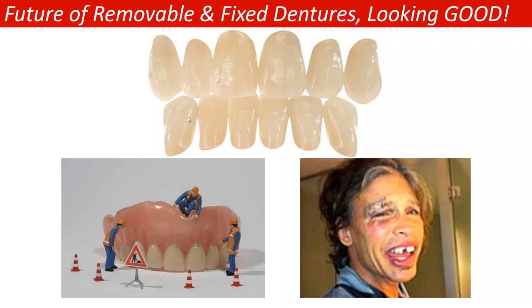If the occlusal table has the right adjustments, there's no interference, and you have that group function, you should not see any denture tooth snapping off, breaking off, cracking, or crazing. That is always a sign of something going on with the patient's bite. Maybe we need to open it. Maybe the occlusal VDO is not correct, but it sounds like there's a lot of interference as the patient speaks, and that's got to be adjusted, no matter what tooth line it is.